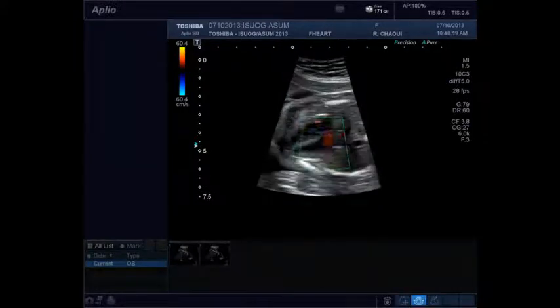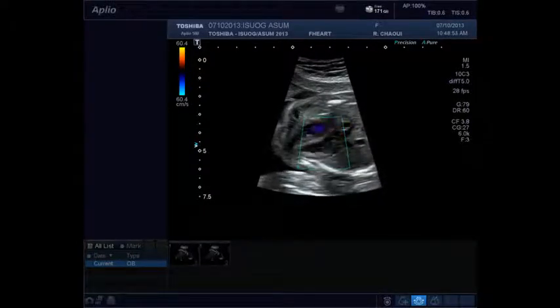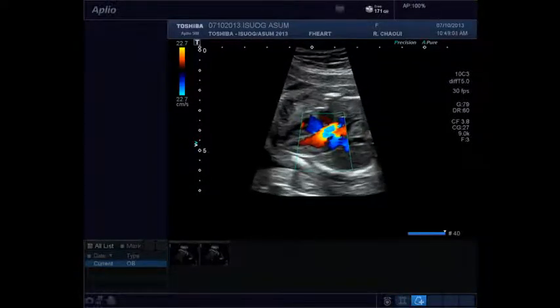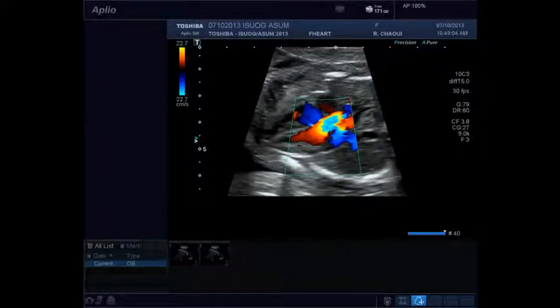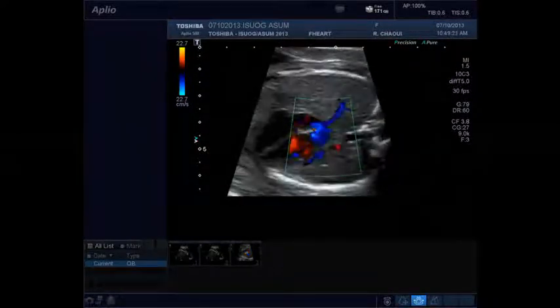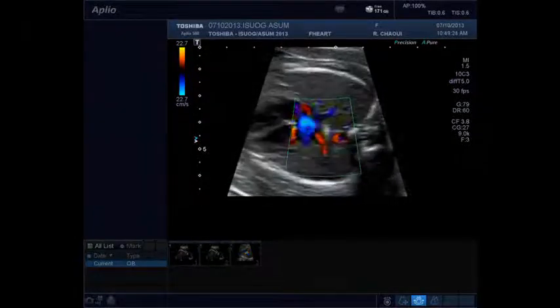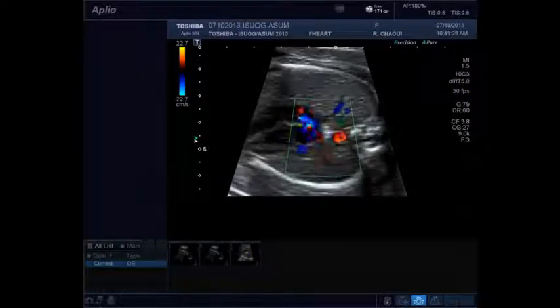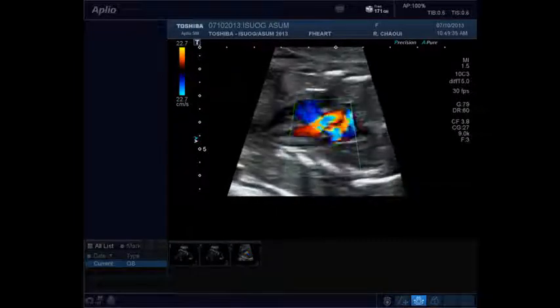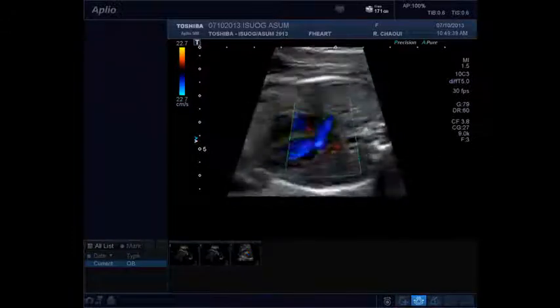So unless you have a preset like this one, where I go down with the peak velocities, and if you store such a picture in your documentation and the child has an aortic stenosis, you may come into trouble. This is why, if you see all the time such a picture, then you should go and Doppler and sample it. And the other exception in my unit or my work is once you have a typical family history of one condition. Let's say one previous case with hypoplastic left heart, aortic stenosis, bicuspid valve, or family history of left ventricular outflow tract obstruction, then I sample the mitral and aortic valve to document that I was targeting this question. This is my opinion.